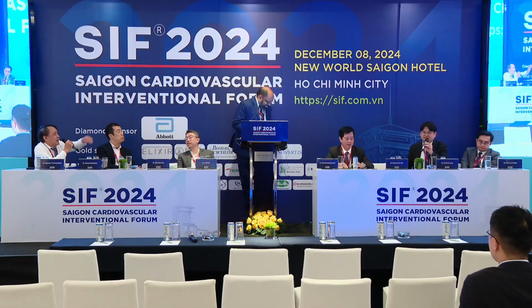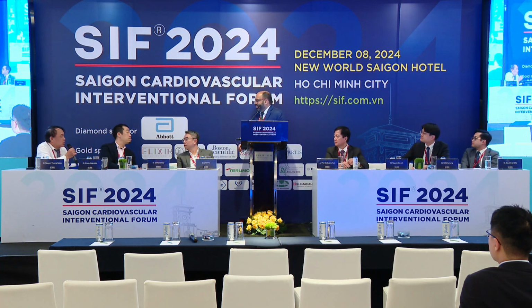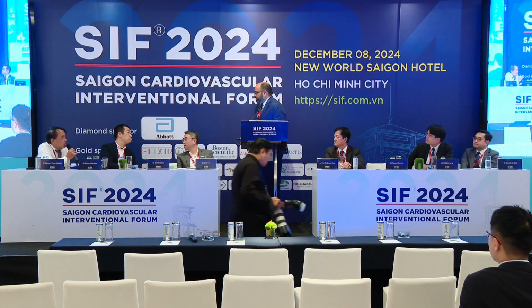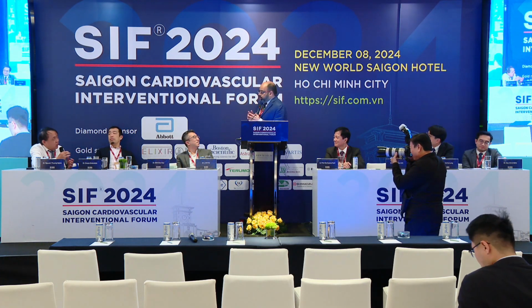Thank you. For the interest of time, we'll move to the next presentation. Would you like to ask a question? Yes. Have you used DCB in the left main? So far, I've not had a reason to put a DCB in the left main. I've done ostial LAD, but I've not done left main. But if the situation arises, like my lady with cancer, if someone like that needed PCI and needed surgery within 1 or 2 weeks, I would not hesitate to do PCI with DCB. If there's a good indication, I would do it.